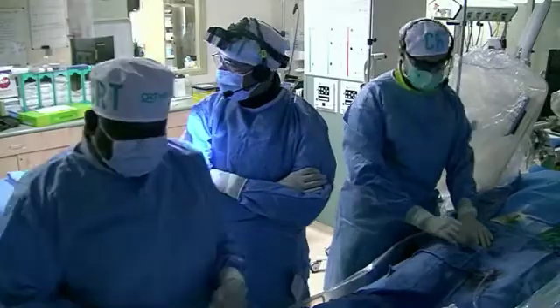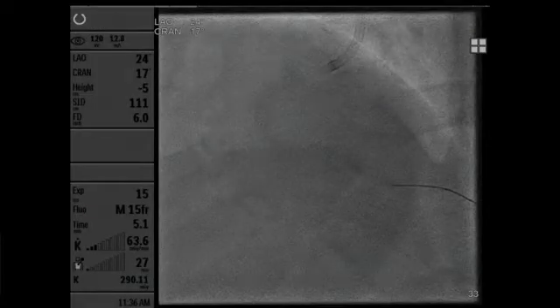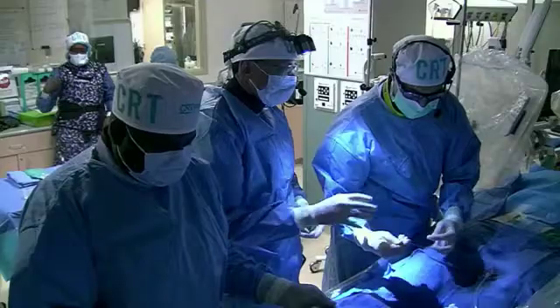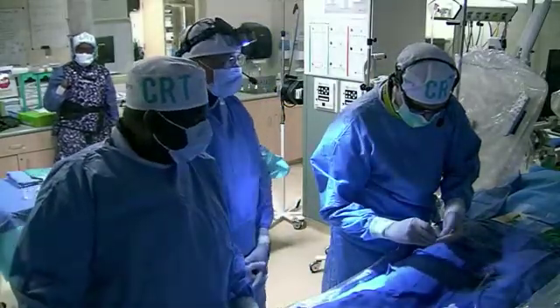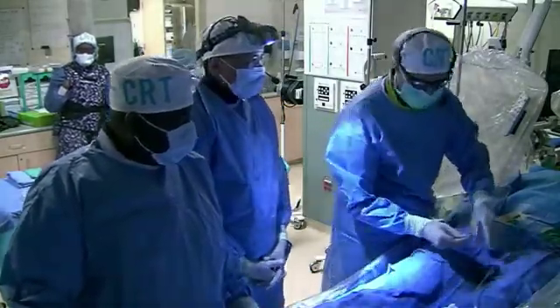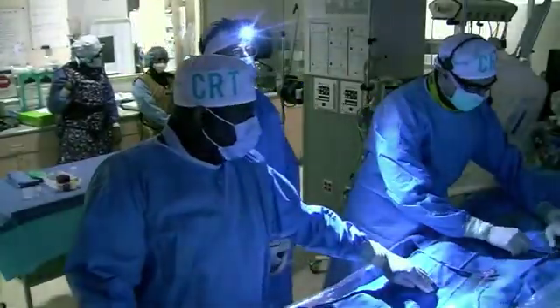Right now, it's our bias. I've been picking the telescope mainly for one simple reason, Ron. It's the way it's manufactured, it's basically woven. So when I go through, I think I did a case with you where we had almost like a 270 turn, and the catheter stayed luminal. What I mean to say is it kept the form without getting any kink on the catheter itself, and that's the reason I use that device these days.